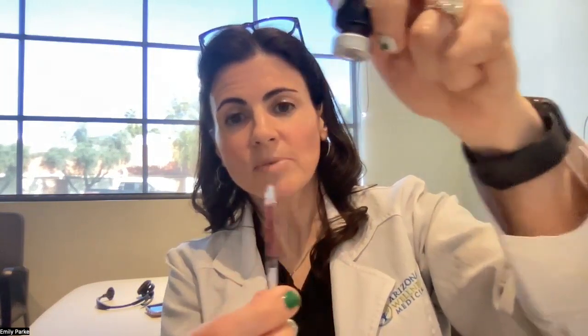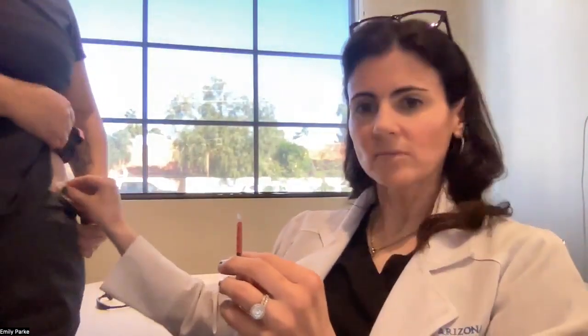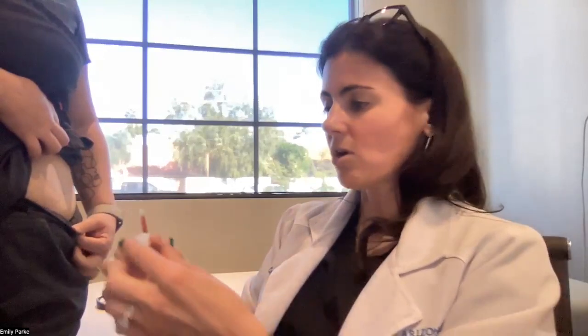Then you can remove the syringe from the vial and set the vial down. You're going to want to get another alcohol pad and clean off an area around the tummy. I like to start in the center and go from the center out to make sure it's all clean.